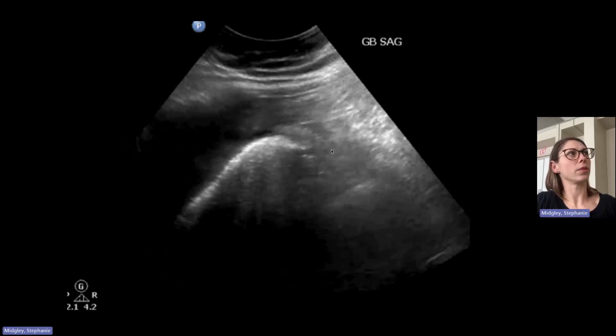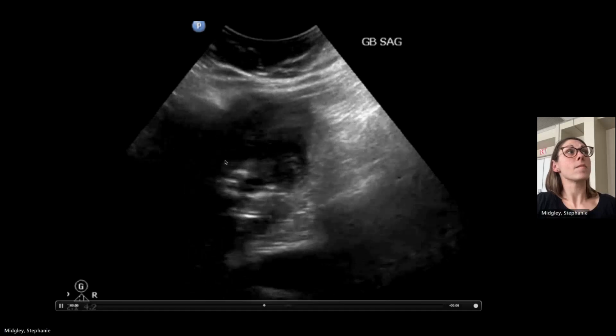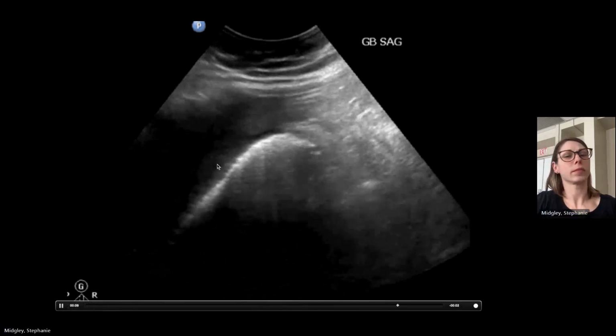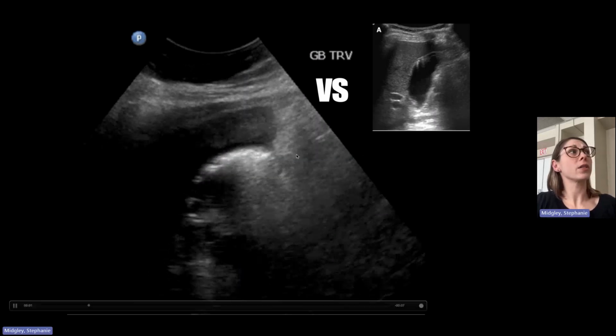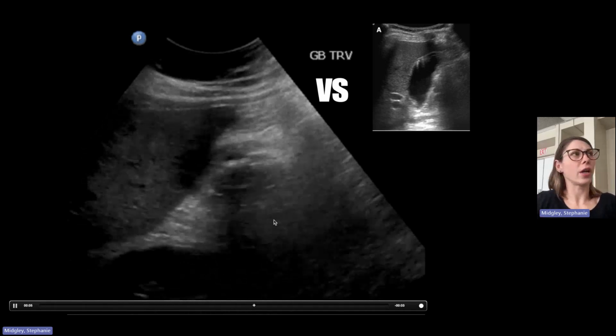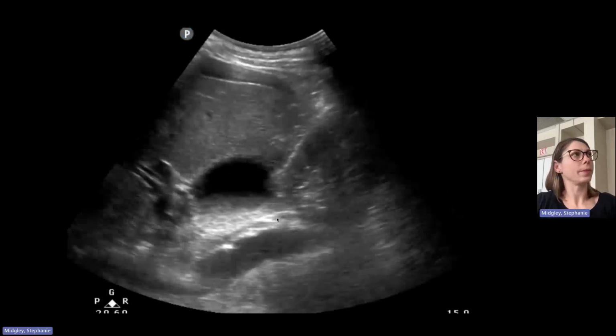Here's another example. That's a shadow. It's going pretty far down. Yeah, right. And then adenomyomatosis is very short. Exactly, right? Because this is air. So air is obscuring your view, right? So you're getting that dirty shadowing and basically can't see anything deep to it. Cool. Nice.